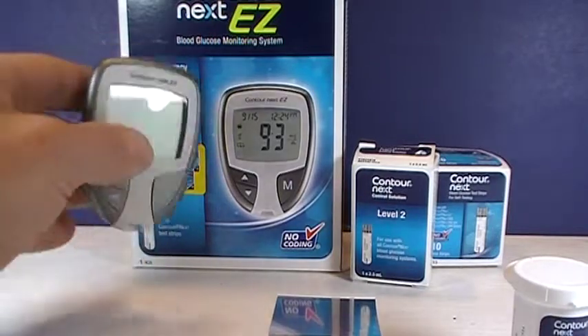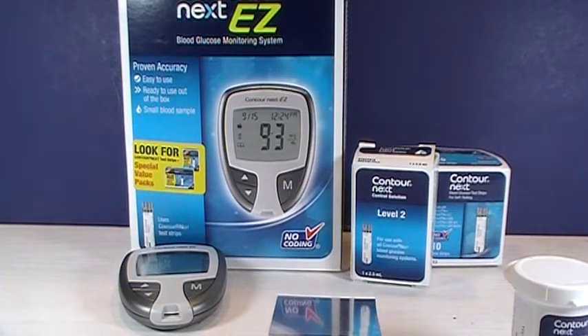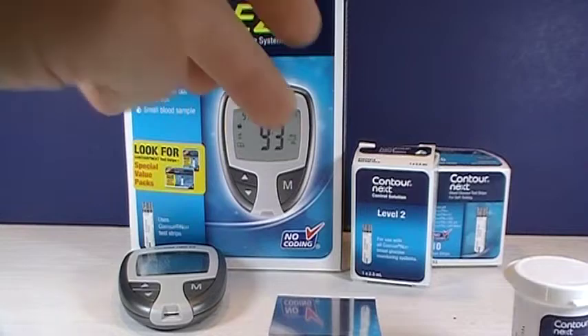In reality, most people use control solution very infrequently. You use it to test the meter if you think the results are off. Most people don't feel the need to test that on a regular basis.